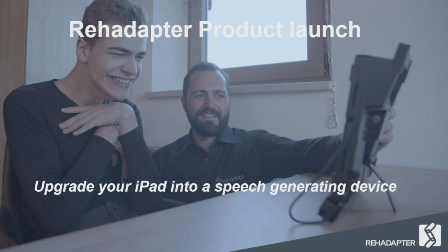I'm happy to introduce you today to the latest development from Rehadapt Engineering, the Rehadapter. It's a big honor that you are here. And today I would like to show you how you can upgrade your iPad and transform it into a full dedicated speech generating device.